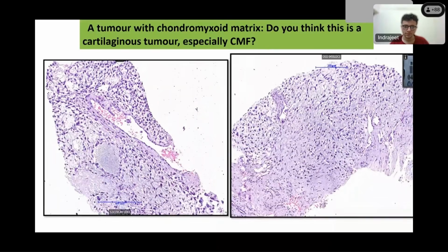Now, this is a tumor. This is a biopsy. What do you think this biopsy shows? Krishna Priya, are you there? This is a genital biopsy, ma'am. I will tell you the details later. Just let us read this biopsy. And let's presume it is a bone tumor.